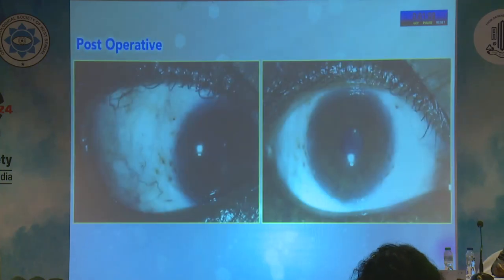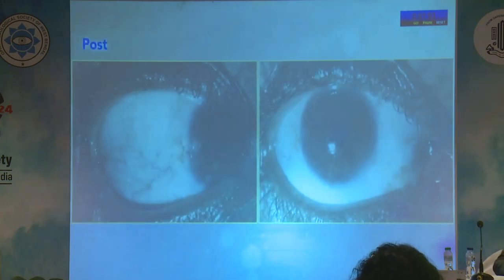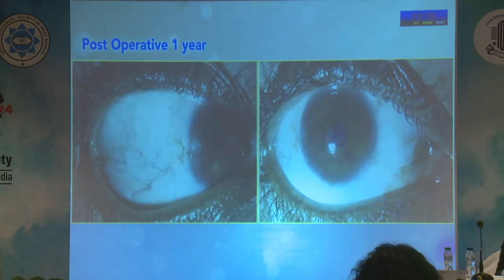Postoperatively, after 1 month, the surface was clear, with little, patchy pigmentation. This is the eye after 1 year, without any complication, and the patient was very happy with the outcome.